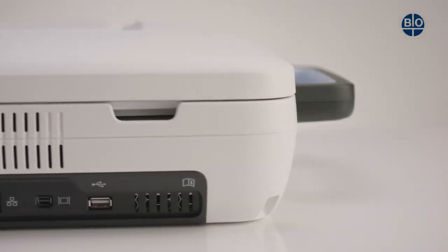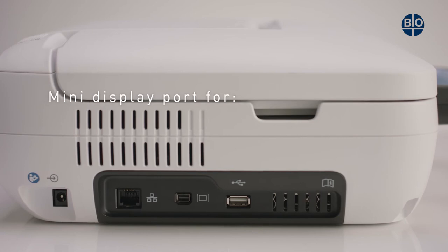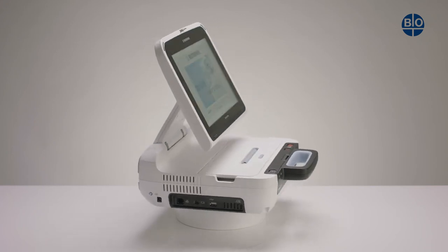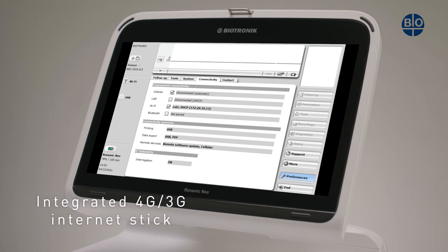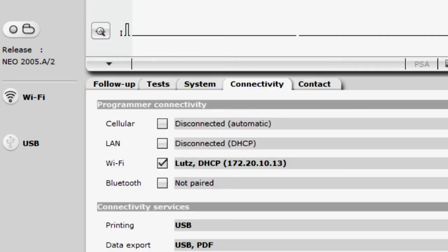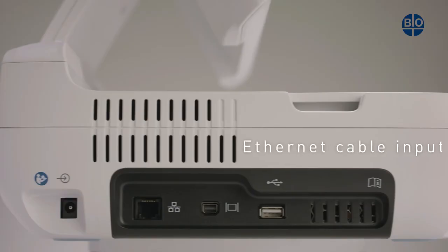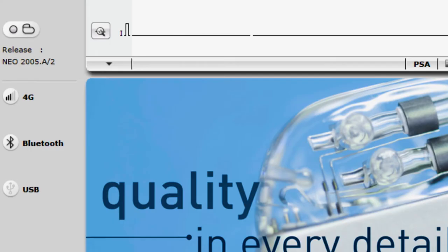The Mini DisplayPort is located on the left-hand side of the device and is compatible with standard HDMI, VGA, and DVI adapters. No additional software drivers are required. Integrated into the device is a 4G and 3G mobile internet stick authorized by Biotronic. The device is also Wi-Fi compatible, has a port for an Ethernet cable, and also has a Bluetooth connection.